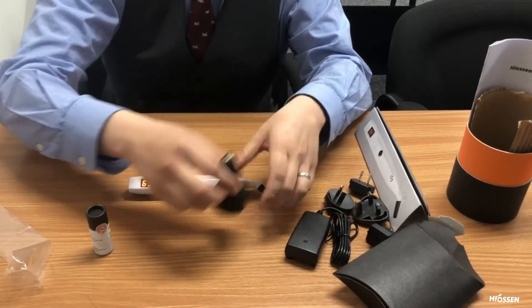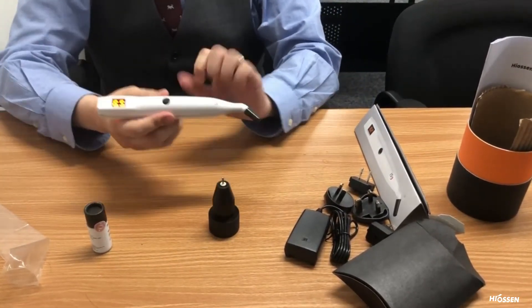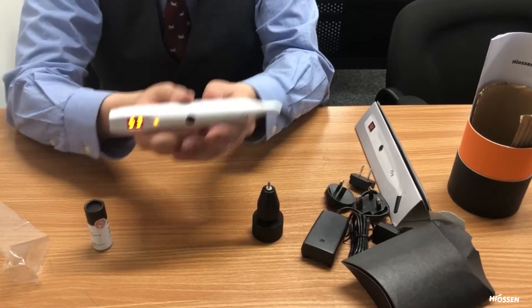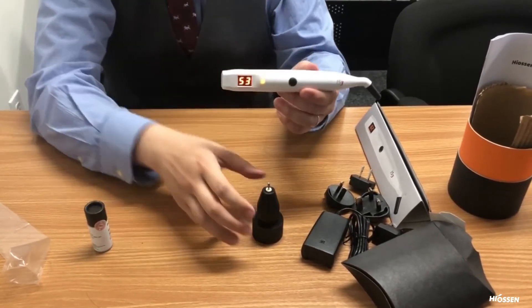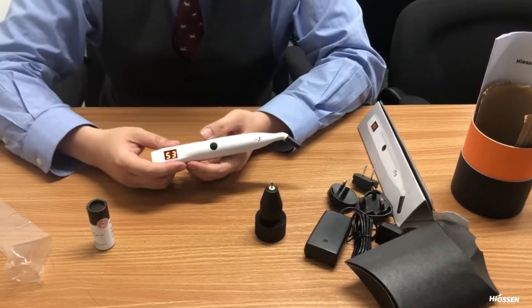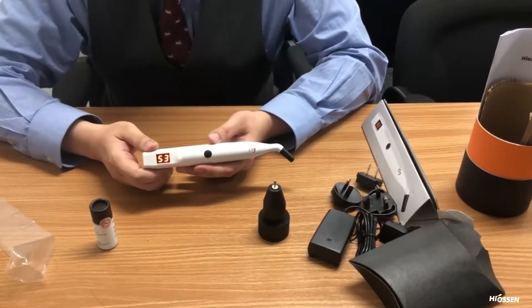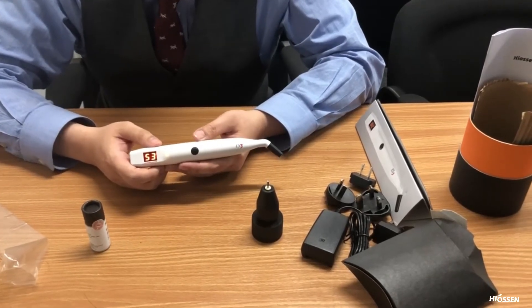I'm going to loosen it, but still tight enough to get some type of reading. We have 65, and now going again we have 53 — it's a little looser. So as you can see, it is pretty accurate, as you can see for yourselves once you receive these.